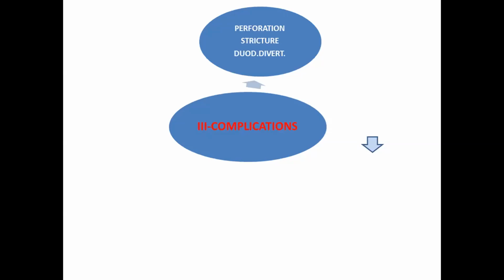And in a small number of patients, with marked inclination between the first and second part of the duodenum, sometimes it is very difficult to pass to the second part. In a small percentage of patients, 1 or 2 or 3 patients every 100 patients, you can screen from the bulb of the duodenum and from the stomach, as we mentioned in the previous webinars on examination of the pancreas from the stomach and the bulb of the duodenum. You can do it from station 3 and 4.